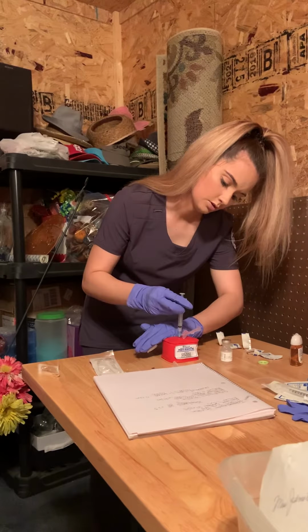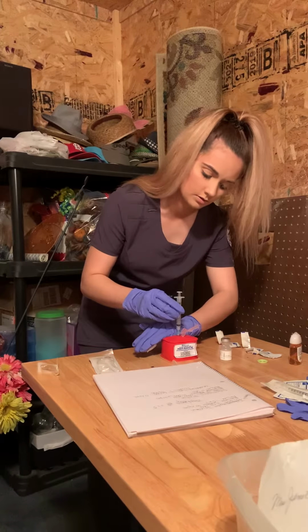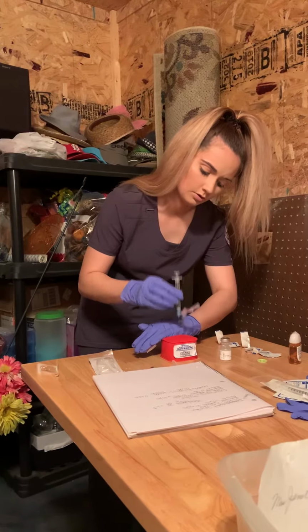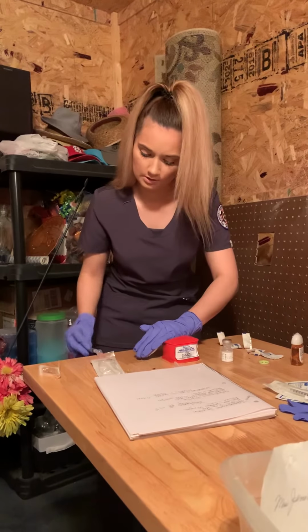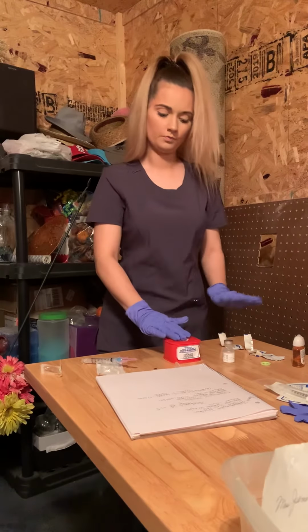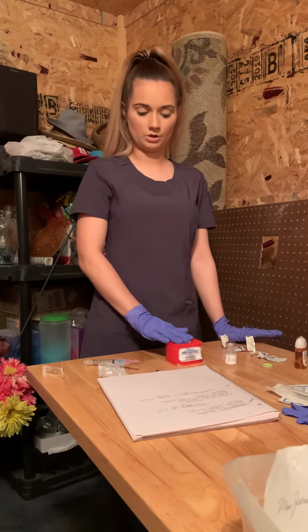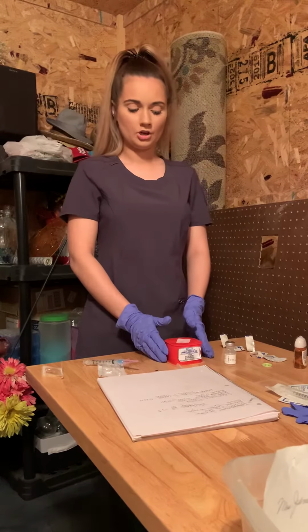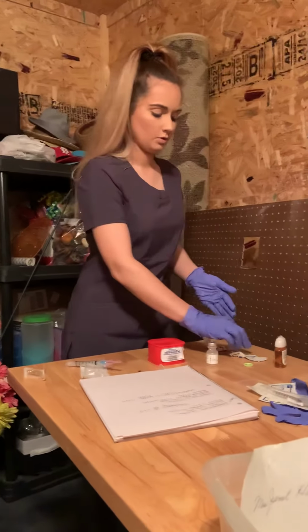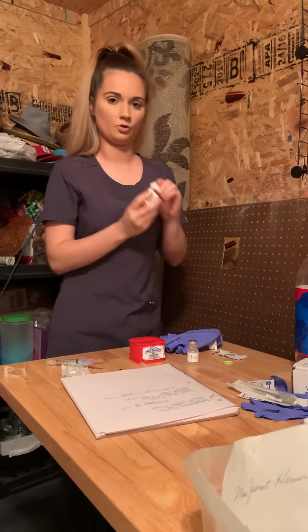You will also want to leave the needle in for about 5 to 10 seconds. When you pull out, you want to gently pull out straight. Engage the safety mechanism. Place your gauze and alcohol pad over. You want to apply gentle pressure. Do not massage it or apply too much pressure. Bandage if necessary. Then you will want to remove your gloves and perform hand hygiene.